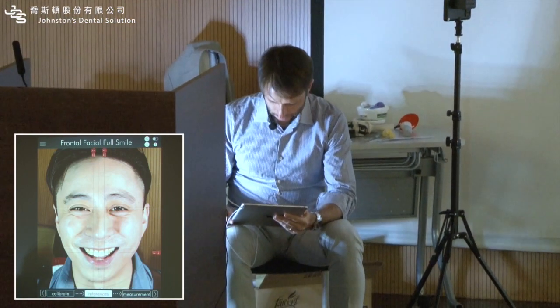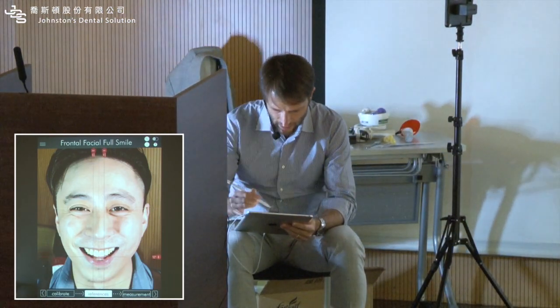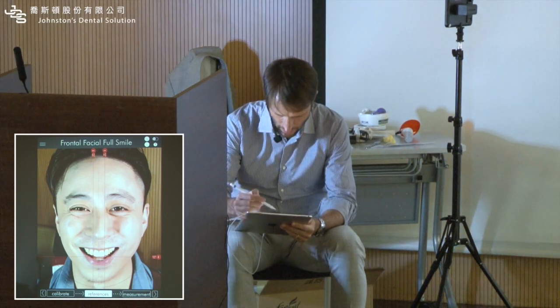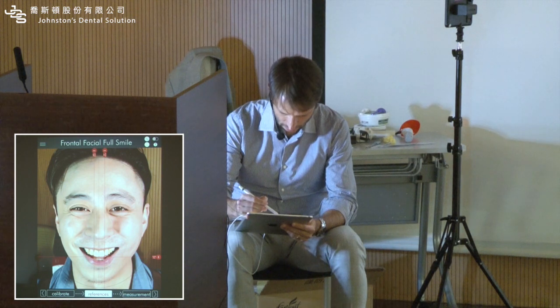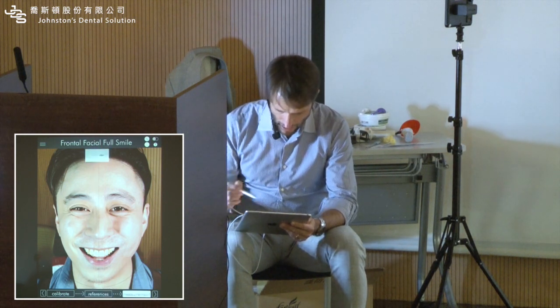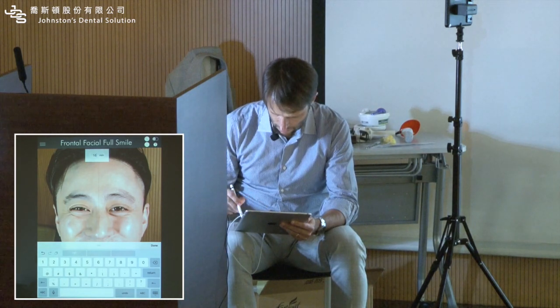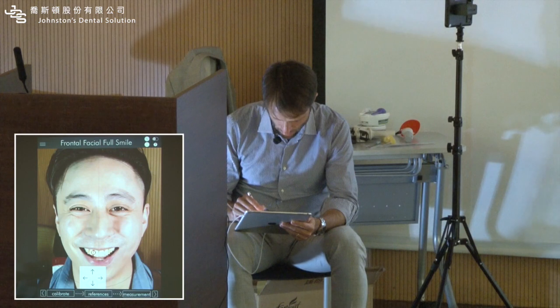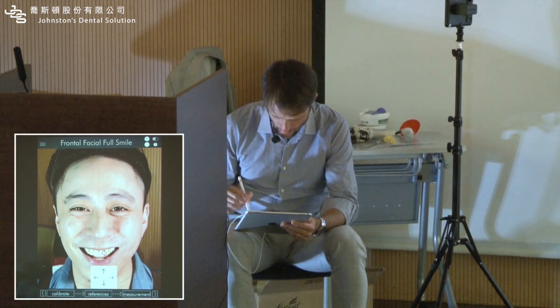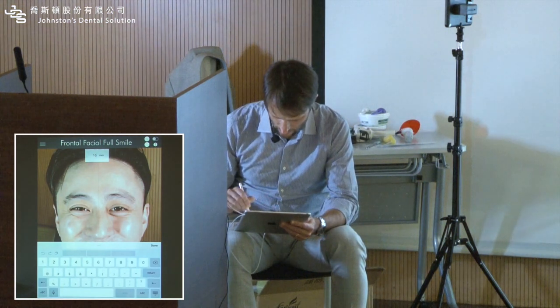Then, next step. And yeah, I want you to see how easy this is, okay? The app is just asking for a few references, okay? So we're going to make some references here. App is asking for a measurement. I don't have it, I'm going to guess, but the app is asking what is the real measurement from here to here. And then, let's say it's 16.5, for example.